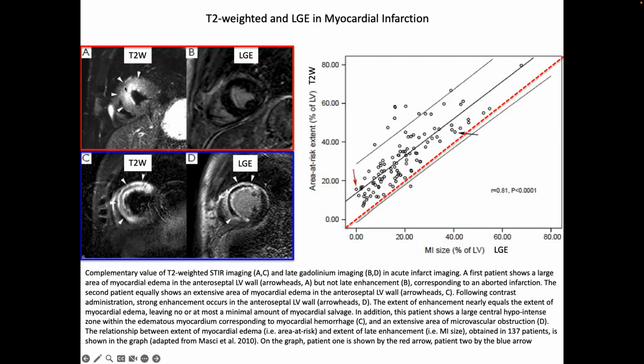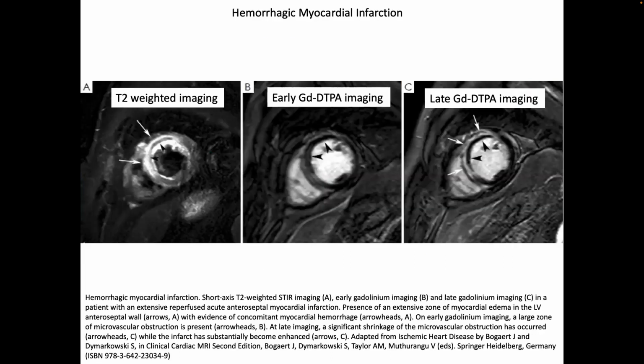But acutely, this tells you the injury is here. Acutely, the late gadolinium enhancement doesn't tell you much. So T2 weighted imaging, early gadolinium, and then late gadolinium, okay? In early gadolinium, you can see there is a deficit where the blood flow just isn't getting to. That deficit is pretty clean right here, and then the tissue where the blood is going, where we have late gadolinium enhancement.